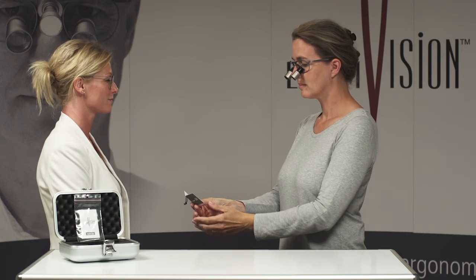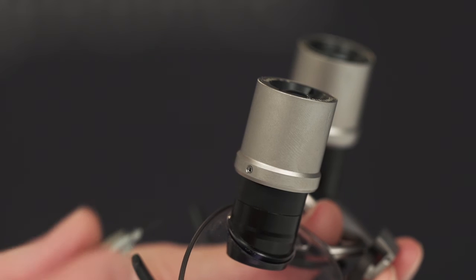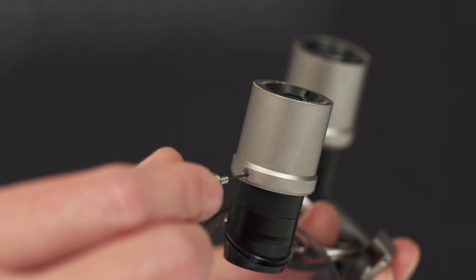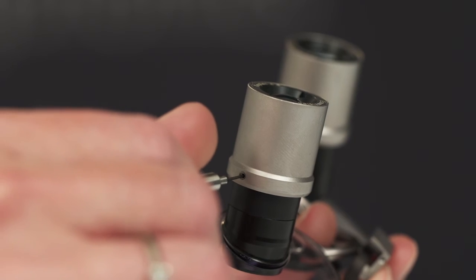When you have found the perfect focus point, lock each objective by gently tightening the locking screw with the Kepler key provided. Tighten the screws evenly to avoid twisting the barrel.